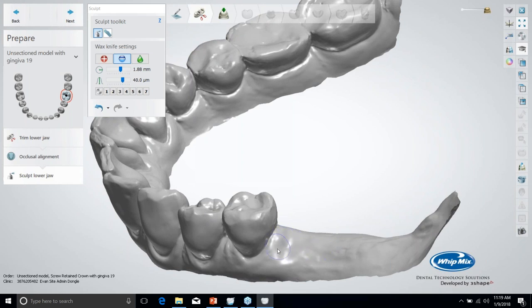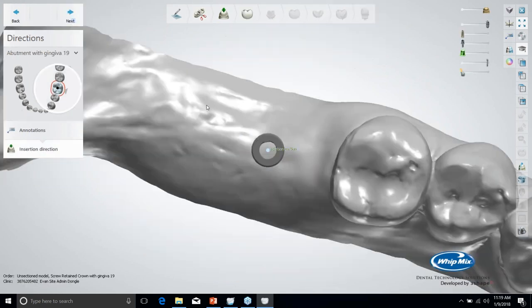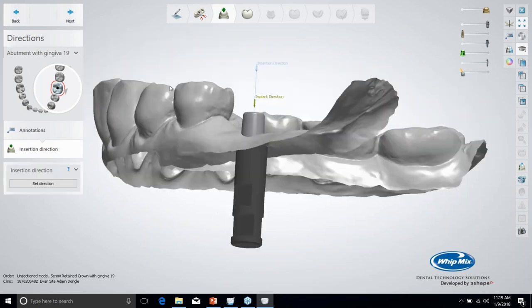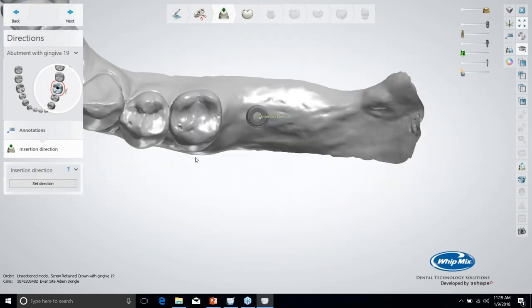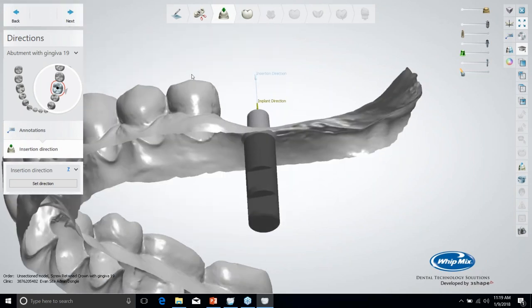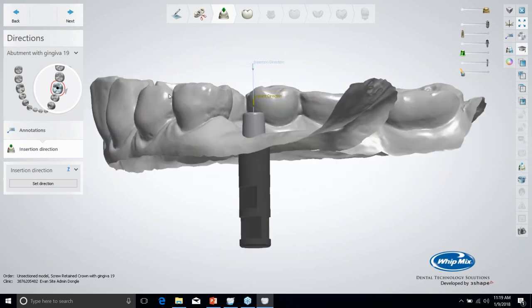But for this, I'm going to make a little bit more room for that tissue architecture. All right, just go next. So this scan actually came out of 3Shape's Implant Studio, where the planning was done for this implant, and this scan automatically has the implant location in it, so I don't have to use a scan body to pick up the location.